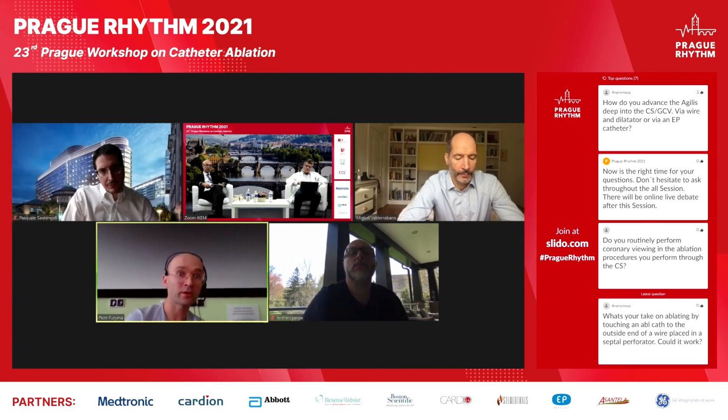So at some point you might require higher energy values, let's say 50 watts or even above 60. There are some papers that describe the use of 70 watts with an 8mm tip catheter in bipolar configuration. So if I require higher powers, then perhaps I may decide to use an 8mm tip catheter in this setting.